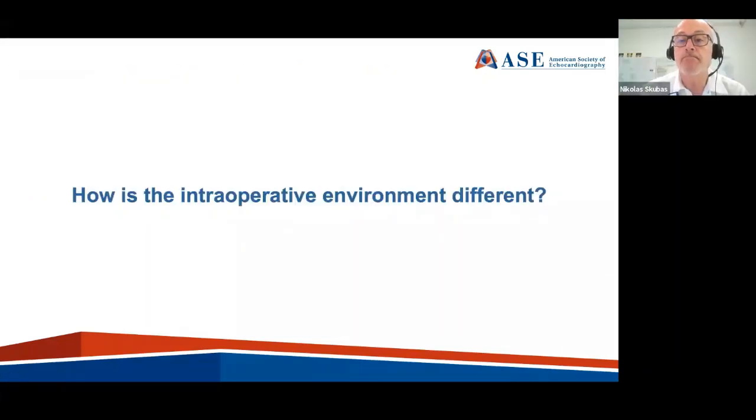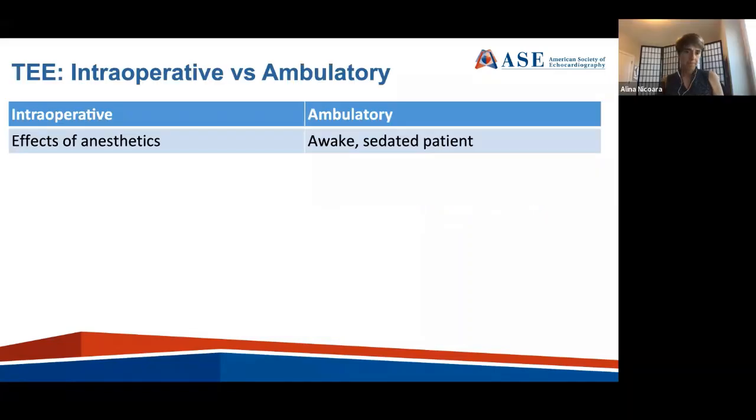So we'll start with the intraoperative environment. Okay. Thank you, Alina, and good afternoon to everybody who has joined us in this webinar. The next slides present the differences in the place where the TEE is happening. We are addressing the intraoperative transesophageal echocardiography, and for those who do not practice in the operating room, there is a difference between the lab, the protected space by the patient's bedside, and the operating room.